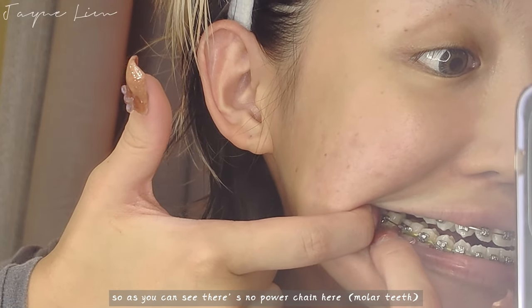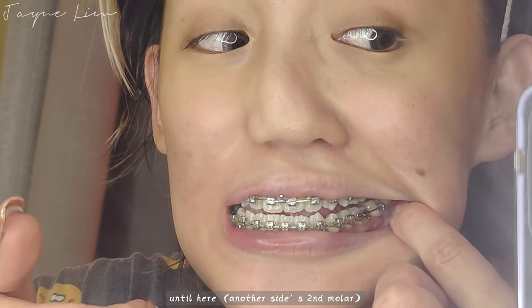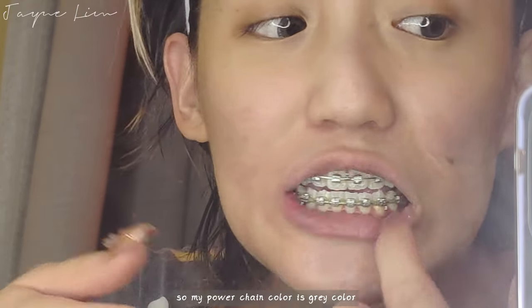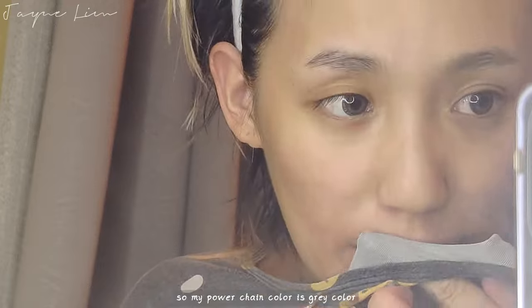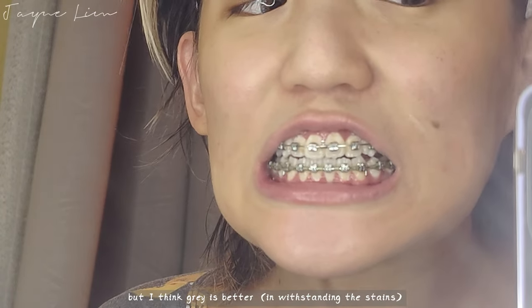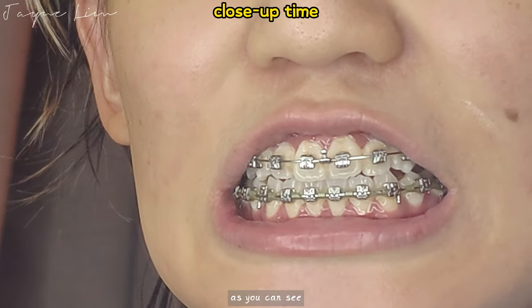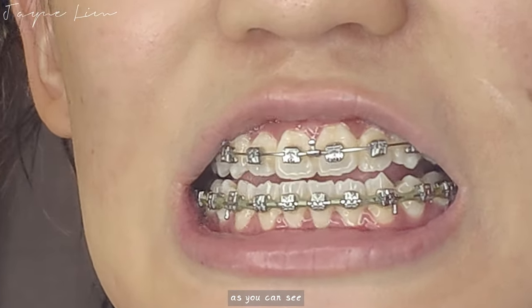As you can see, there's no power chain here, but it starts from here until here, and there's no power chain here either. My power chain color is gray — I wanted to choose pink, but I think gray is better. Here's a close-up.